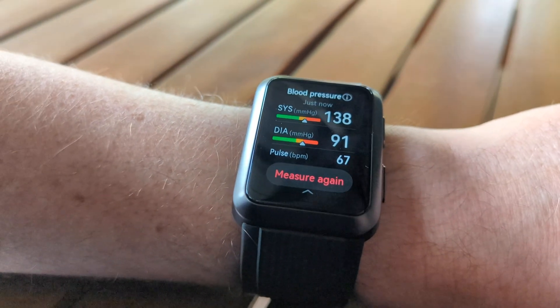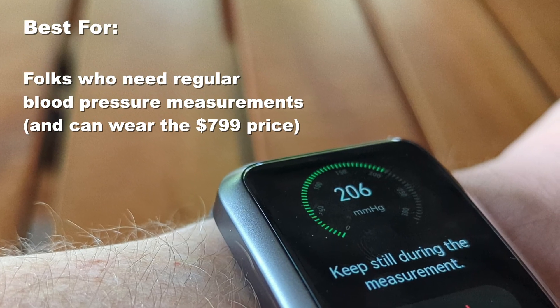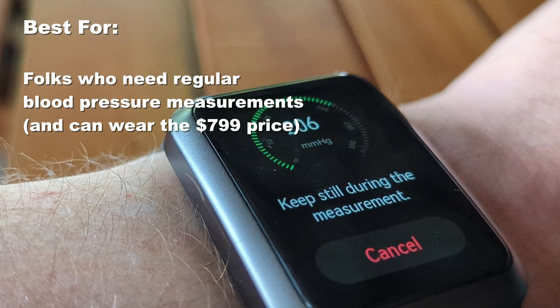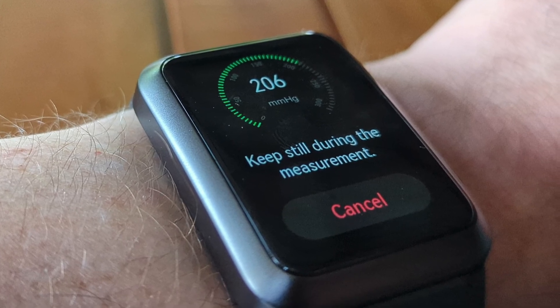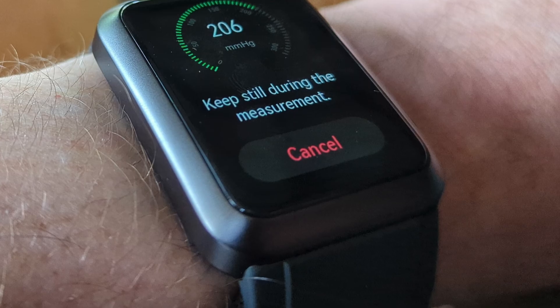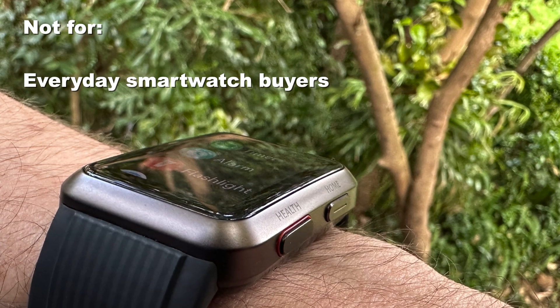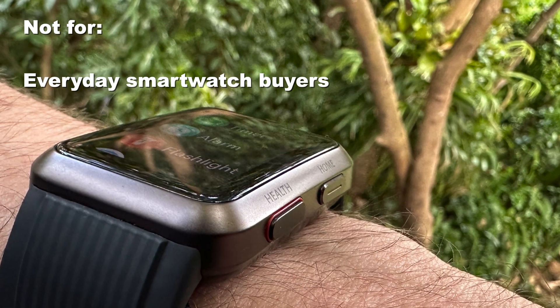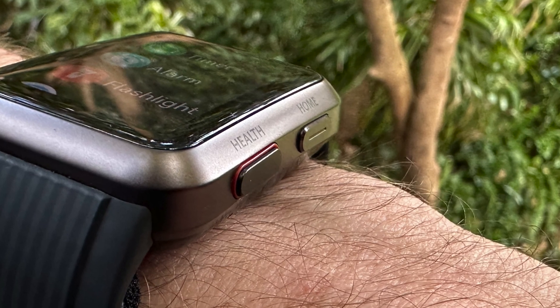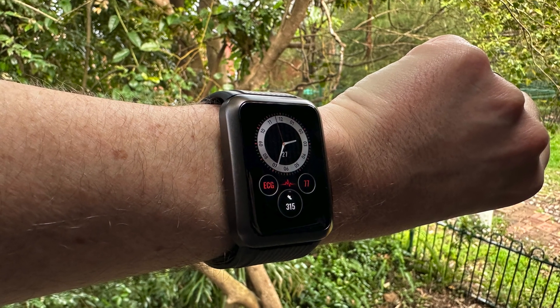So who is this best for? If you genuinely need blood pressure sensing, it's critical to your health, you want a smartwatch, you're fine with the sideloading aspect on Android, and you want the battery life — this is not a terrible buy. But I don't think it's a great value buy. For a lot of people in that bucket, you could do just as well with a cuff and a different, cheaper smartwatch. For everyone else, it's a really cool idea. I love that Huawei has done this, and maybe if they can iterate and make the bands and compression cuff more integrated and durable, that could be a great Watch D2 or D3 down the track. But right now, this is one to keep an eye on in the market — at that $799 price point, it's a bit of a hard sell.